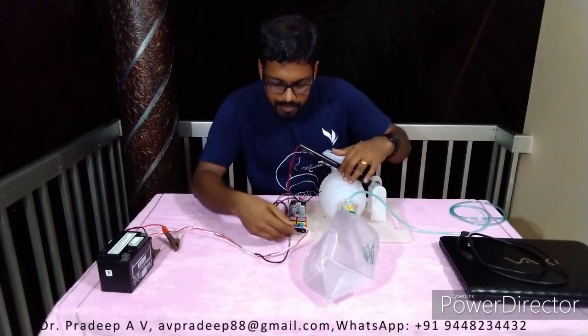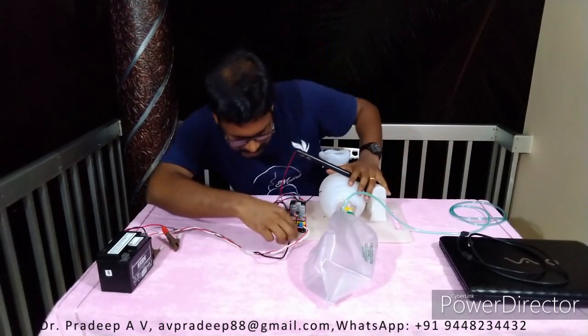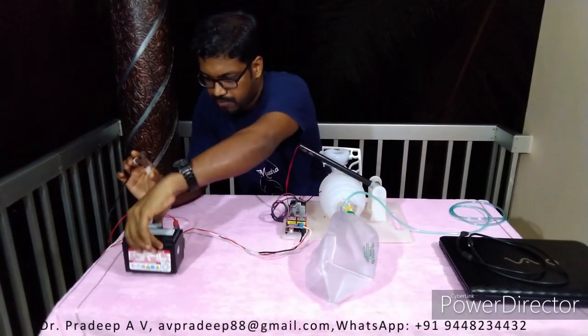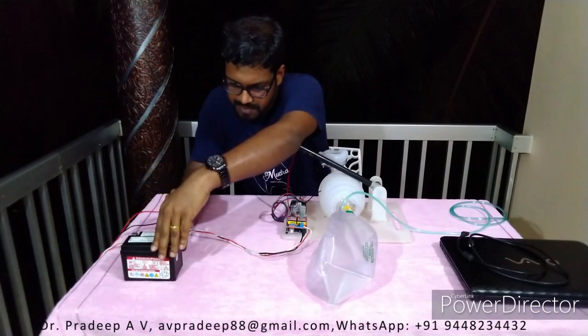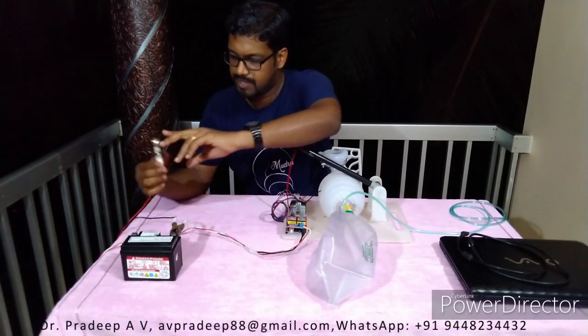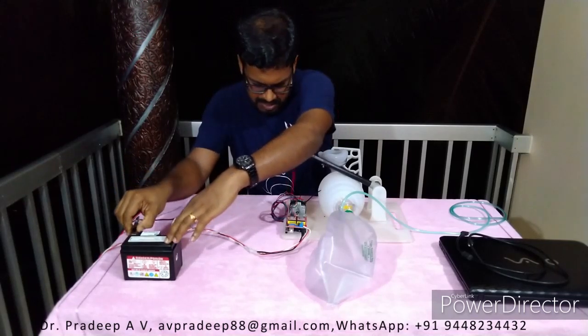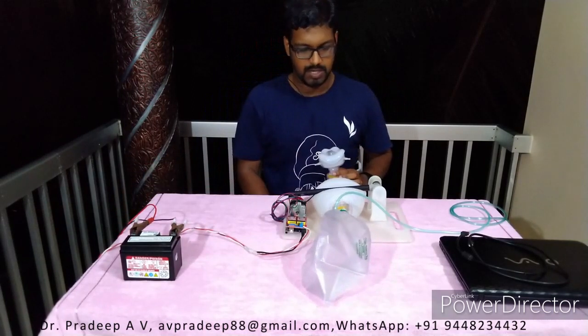And I have to power the Arduino. What is its power? It's supposed to be here. Yeah. I'm going to hook up to the battery, and this is negative, so the black one is negative. It's going here, and this red one is positive. Yeah. So this is the operation.